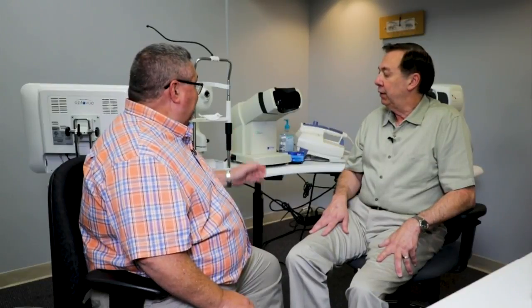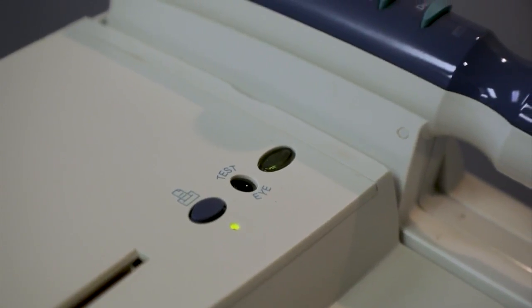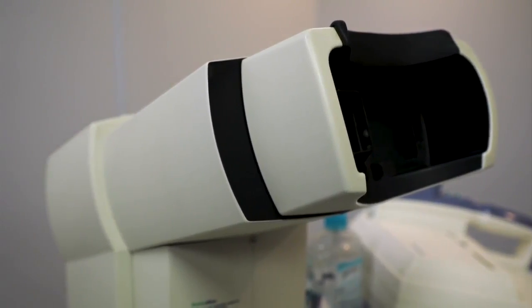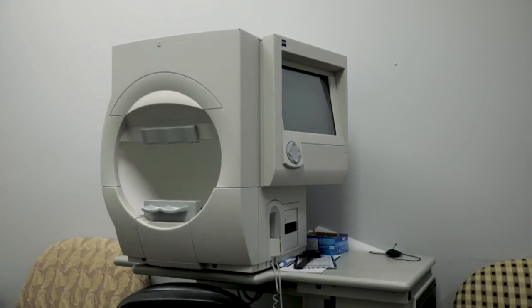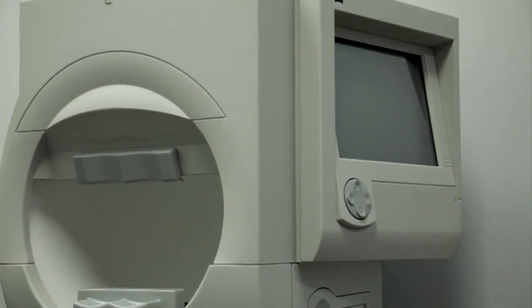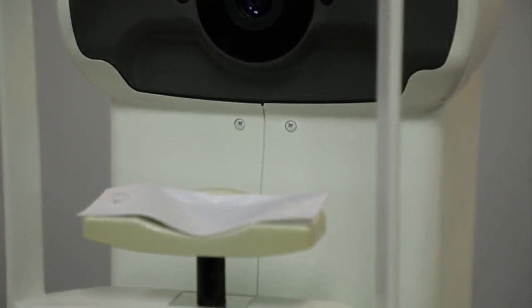You've got a couple other pieces of equipment here you want to talk about as well. These are the ones that have been around for a while. This measures the pressure of the eye. And this is a screener for visual fields, but then we have a bigger one that gives us more in-depth visual fields. That's part of glaucoma treatment and diagnosis. And then we have an autorefractor, which gives us a starting point for the patient's prescription.